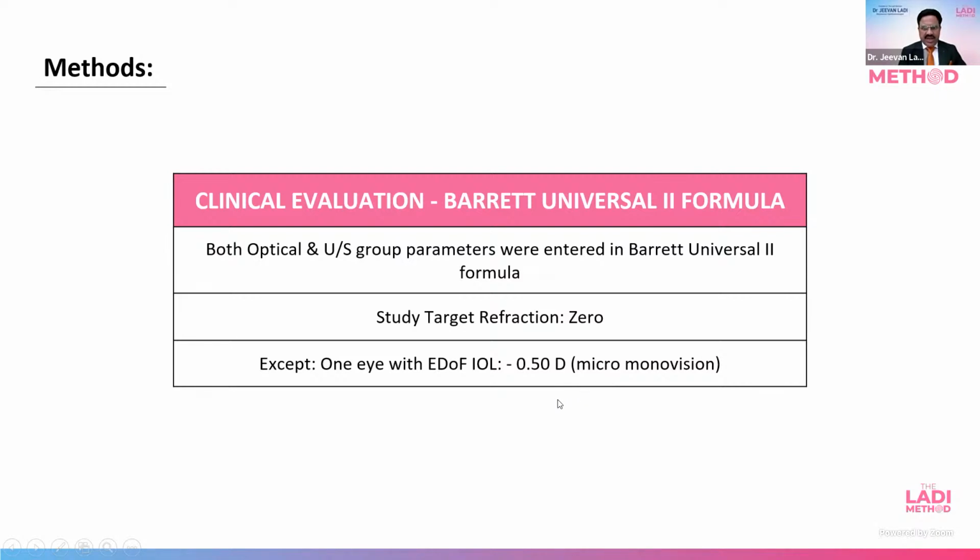At least in India, we try to keep in EDOF IOL the right eye emmetrope and the left eye a little bit myope for a good near vision, as this is a distant and intermediate dominating lens. So by achieving this, we can get a good range of vision. We correct the right eye for emmetropia, the reason being that there is right-hand drive in India and many roads are small and don't have dividers, so that a driver can see very well the opposite traffic coming towards him.